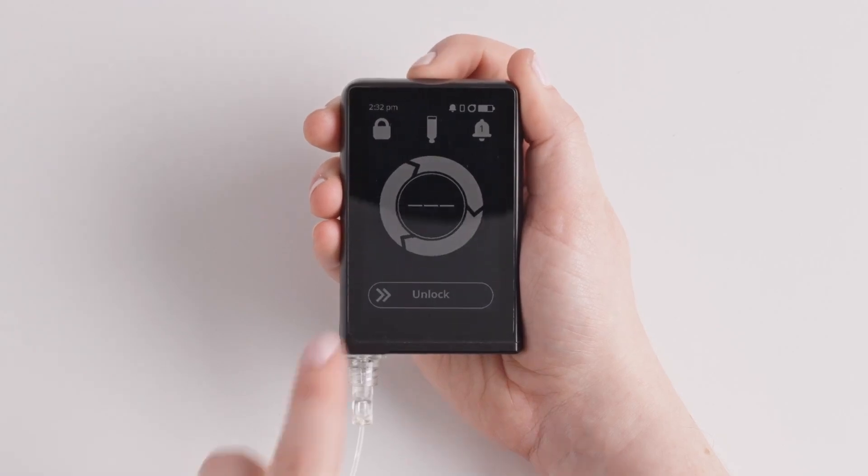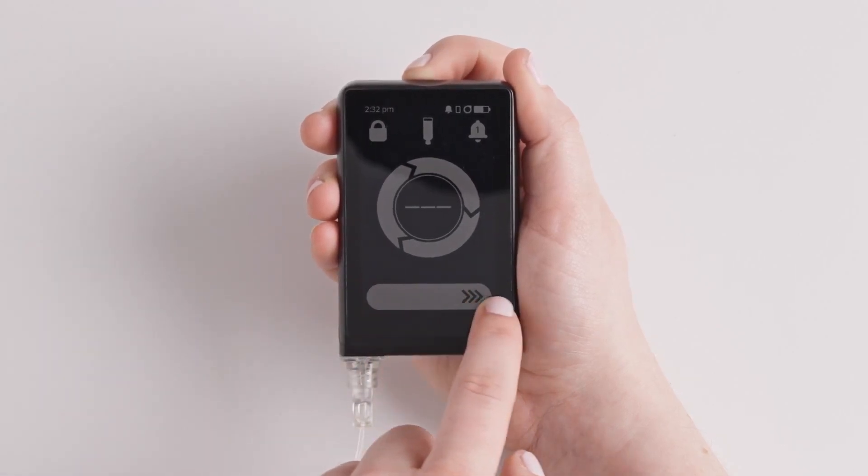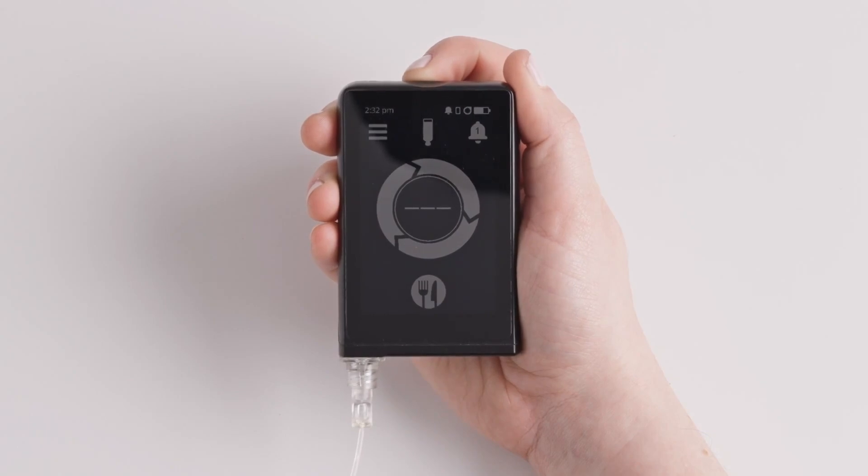If you can, avoid switching your CGM sensor type before bed or any other time when you are not able to monitor your glucose levels for several hours after the change.